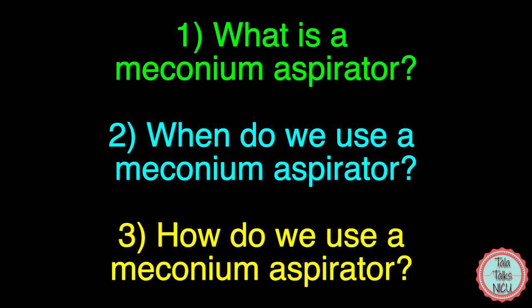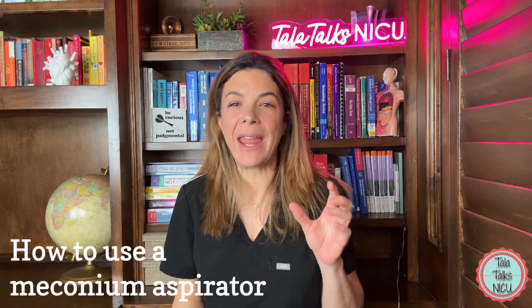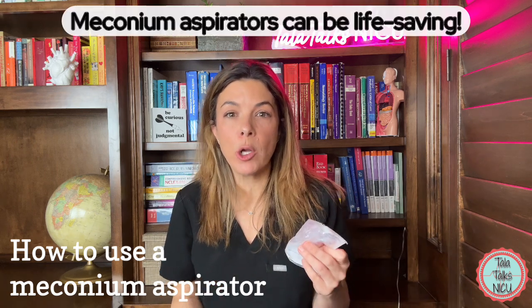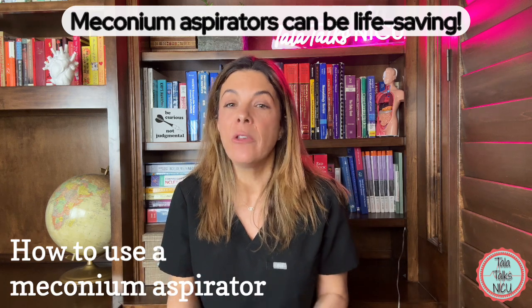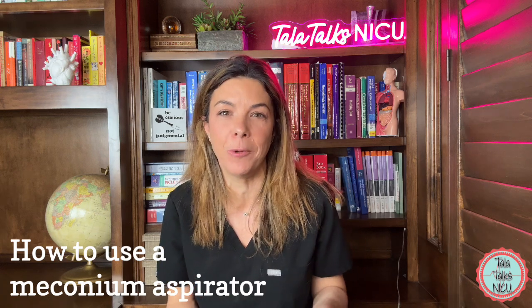We'll cover: one, what is a meconium aspirator; two, when do we use a meconium aspirator; and three, how do we use a meconium aspirator. If you're just interested in the how-to, then skip along to the end of the video. They are a very useful tool to have, because sometimes a meconium aspirator is literally the difference between being able to oxygenate and ventilate a baby. Hopefully by the end of this video, you're going to feel completely comfortable using one too.